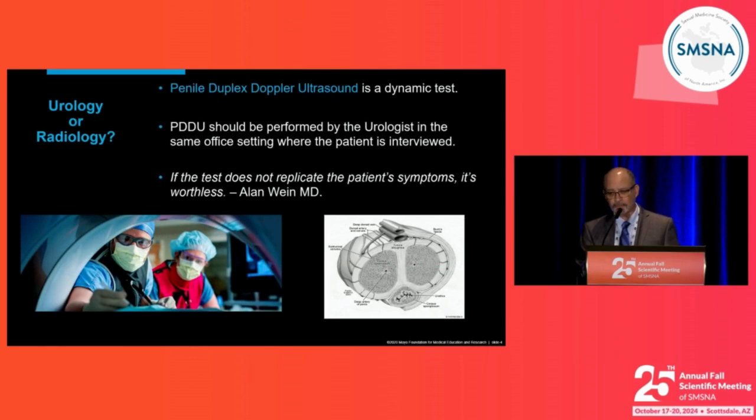So penile duplex Doppler ultrasound is a dynamic test, and I believe it should be performed by the urologist in the same office setting that the patient is interviewed.